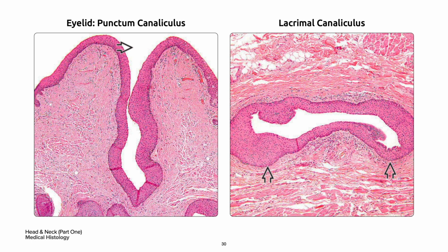On your right, the tears will drain from the punctum into the lacrimal canaliculi in bold black arrow. The paired canaliculi, which are composed of one superior and one inferior, are located in the medial portion of each eye. The lining is composed of stratified non-keratinizing squamous epithelium.